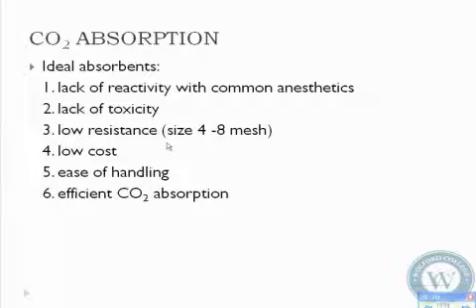But until the 90s, we had one that was commonly used called Baralyme. And Baralyme had a reaction that occurred when you turned sevoflurane on with it that caused it to burn up. I mean, literally, if you touched your hand to it, it would be hundreds of degrees at times. It gets really, really hot. It's an exothermic reaction that can occur in these. So now there's only two types that are really used, the soda lime and the Amsorb.